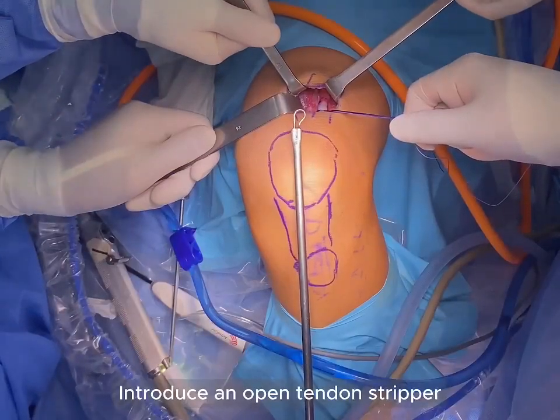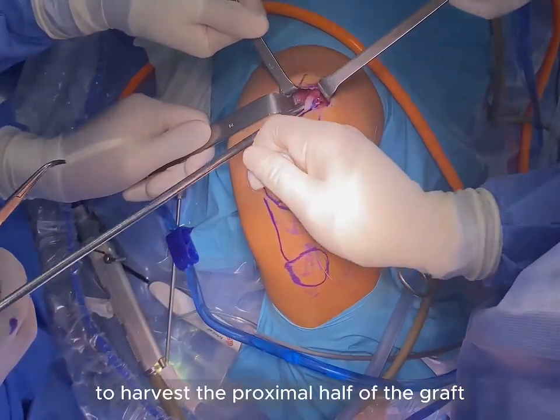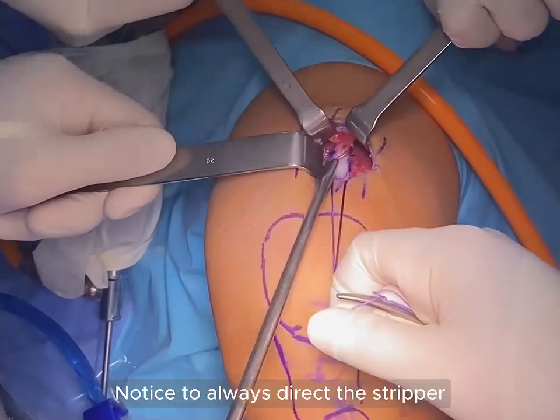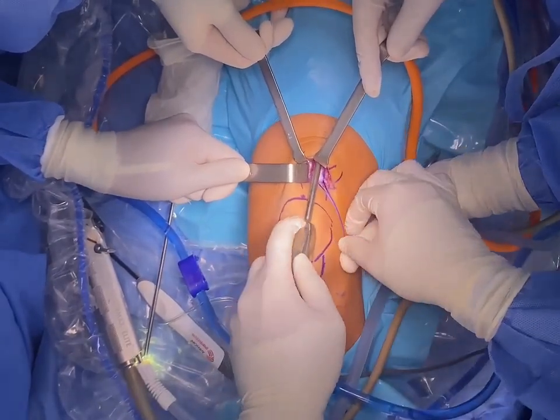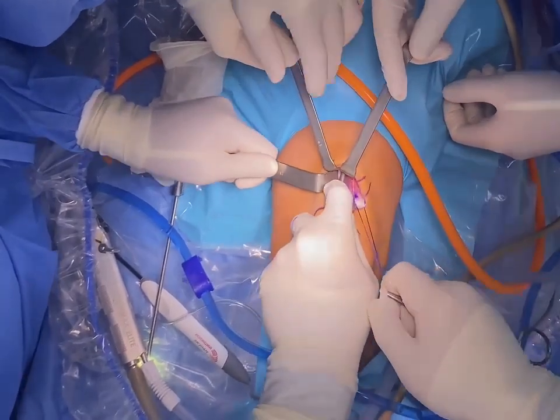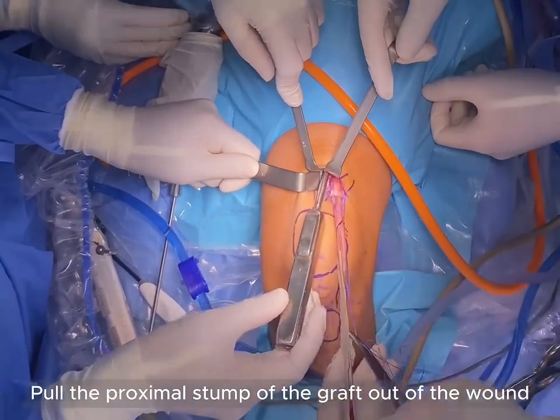Introduce an open tendon stripper to harvest the proximal part of the graft. Notice to always direct the stripper towards the anterior inferior iliac spine. Pull the proximal stump of the graft out of the wound.